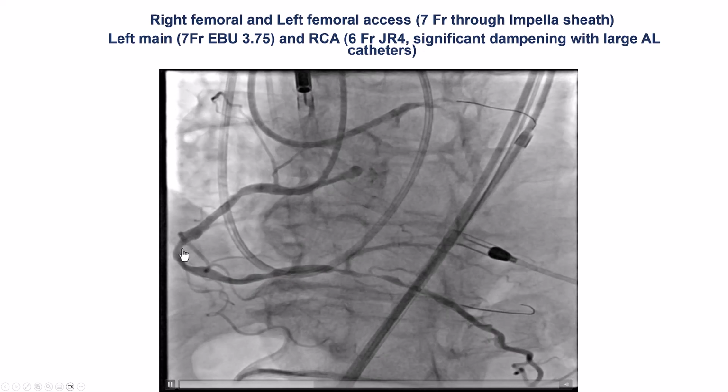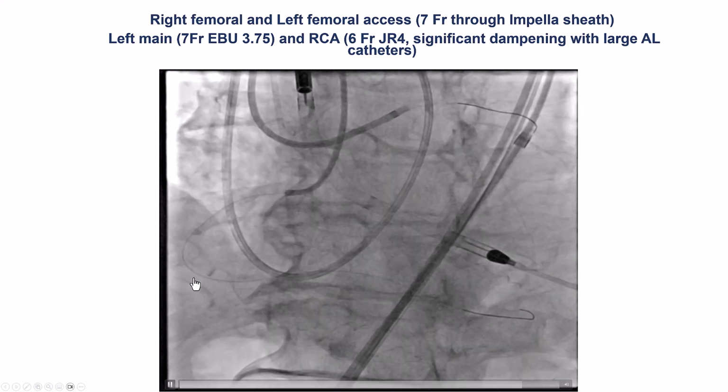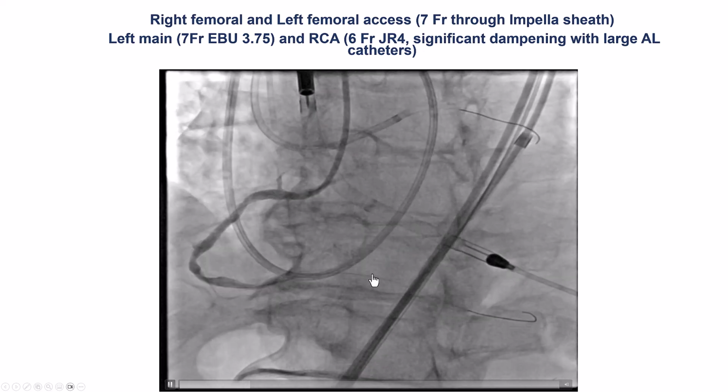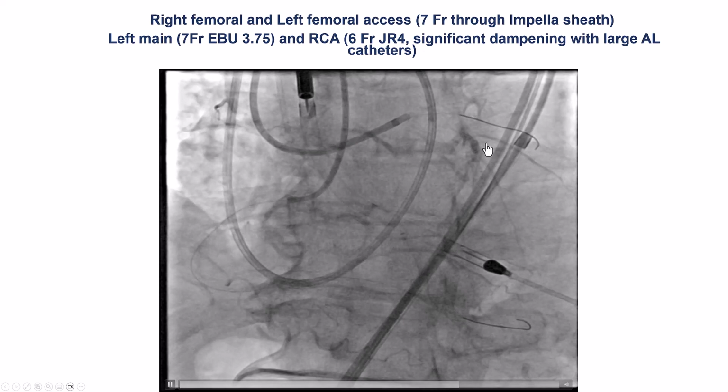This is the angiogram. We do have multiple lesions in the right coronary artery. Distal to mid right coronary artery, there is a lesion in the PDA. There is retrograde filling of the LAD.